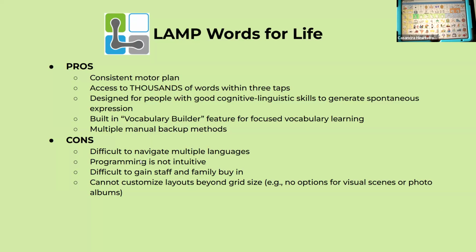Cons, it's difficult to navigate multiple languages. The programming is not intuitive for many of us. It's really difficult to gain staff and family buy-in because people often are like, this one looks weird. I don't like it. And I think it looks weird too.